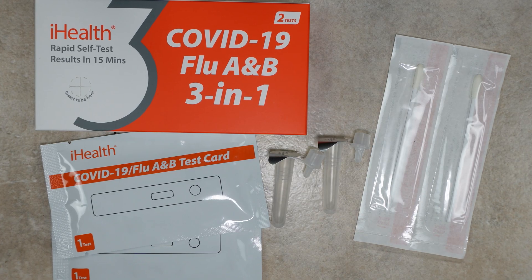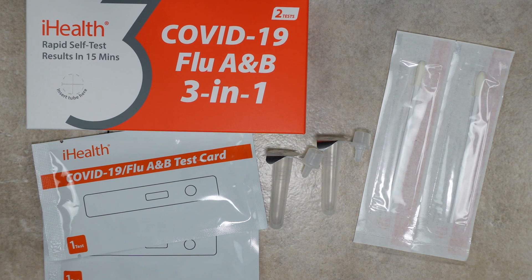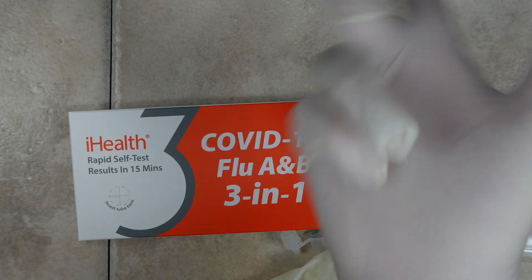The instructions say that the test kit needs to be at room temperature. They also say to clean the surface where you're going to administer the test, and to wash your hands for 20 seconds. They recommend that you wear gloves as you do this test, and that's what I'm going to do.